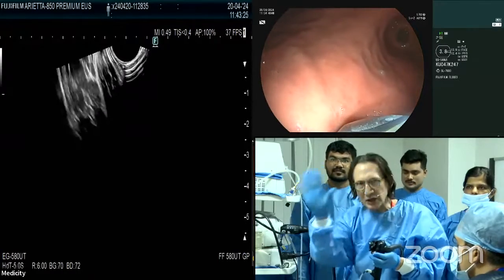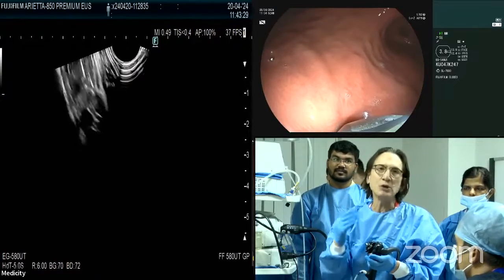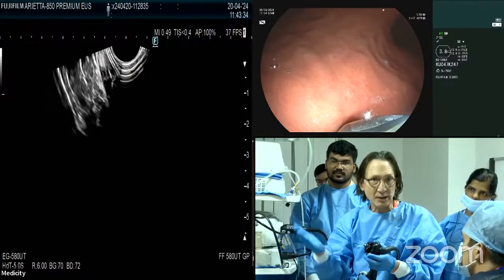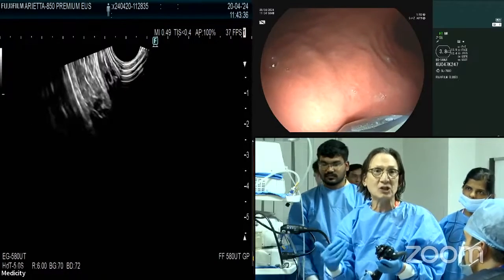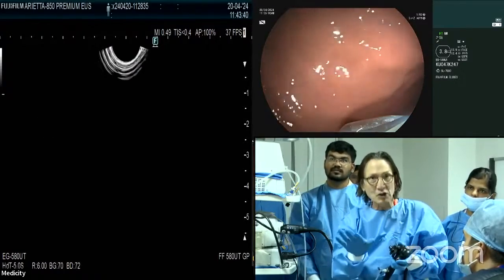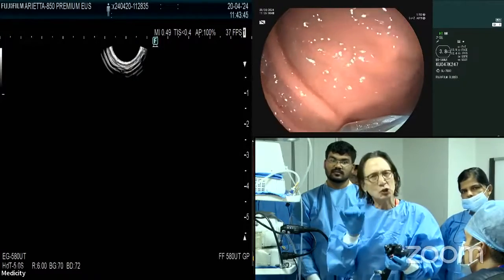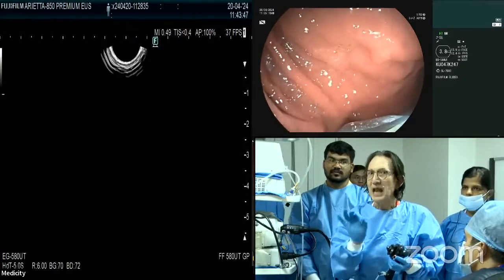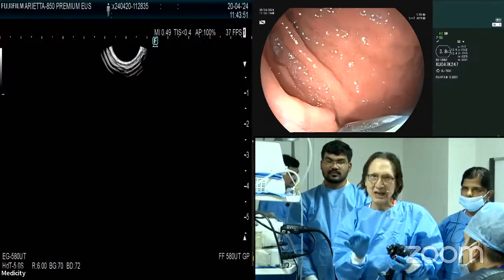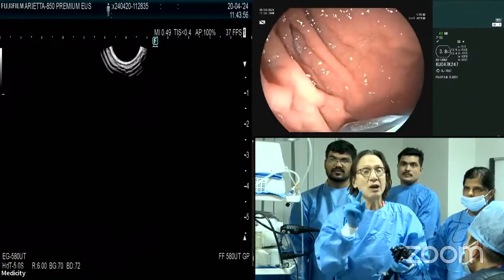Because of time I'm not going to do a complete endoscopic ultrasound, but I normally always start with the biliary system, pancreatic head, etc. That's important information you need in a patient with gastric varices. Today I just want to show you the key points — how to get quick access to visualize gastric fundal varices with endoscopic ultrasound.